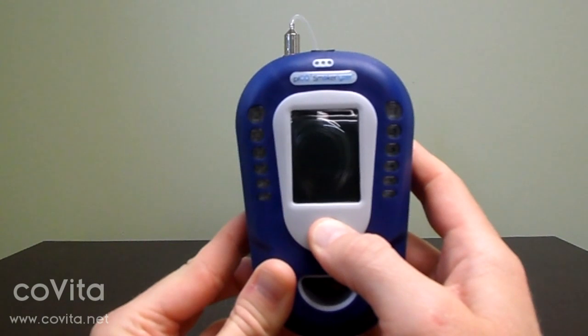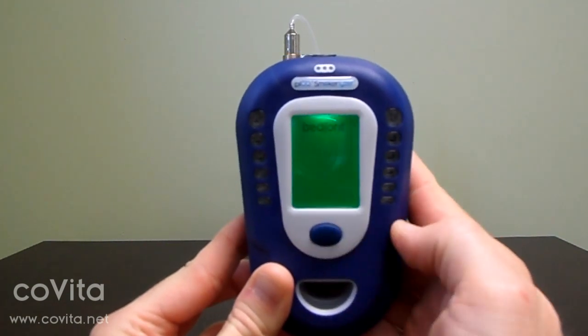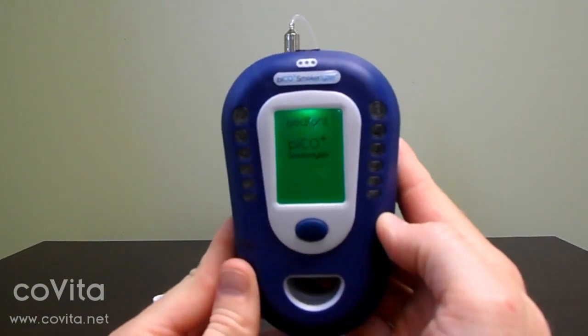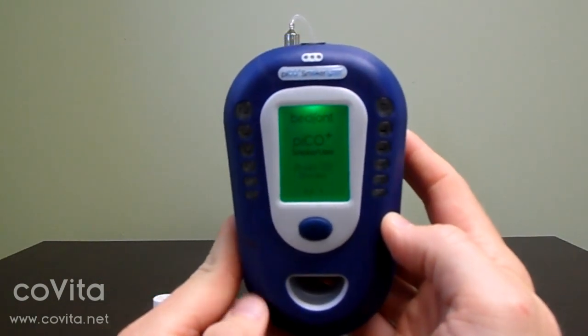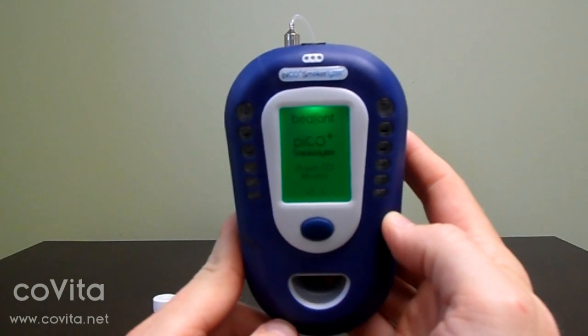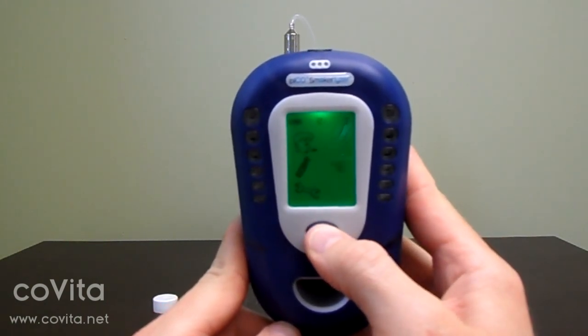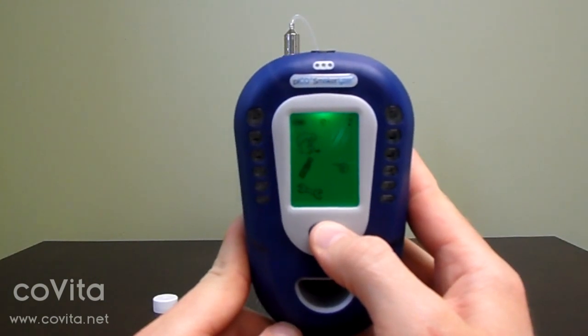Now, turn your monitor on by pressing and holding the power button for three seconds, then releasing. Allow your monitor to boot up to the home screen. Once on the home screen, single click to scroll down to the can of gas, then double click to select the can of gas.